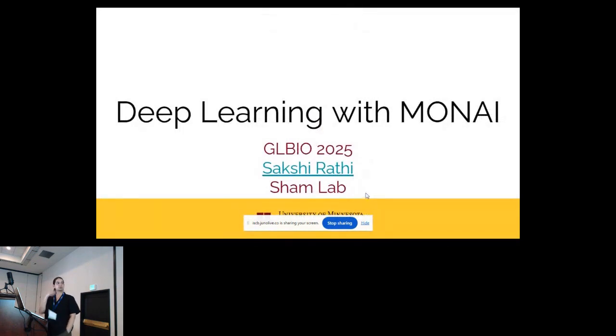Hi everyone. So today we have seen a lot of data sets related to the brain and TBI, traumatic brain injury. What we will be going through in this session is how we can use the data set to train a model and predict our own masks or annotations or segmentation, whatever you want to call it, and we're going to see how good a model performs as compared to someone creating a segmentation by hand or as compared to what a radiologist would see.